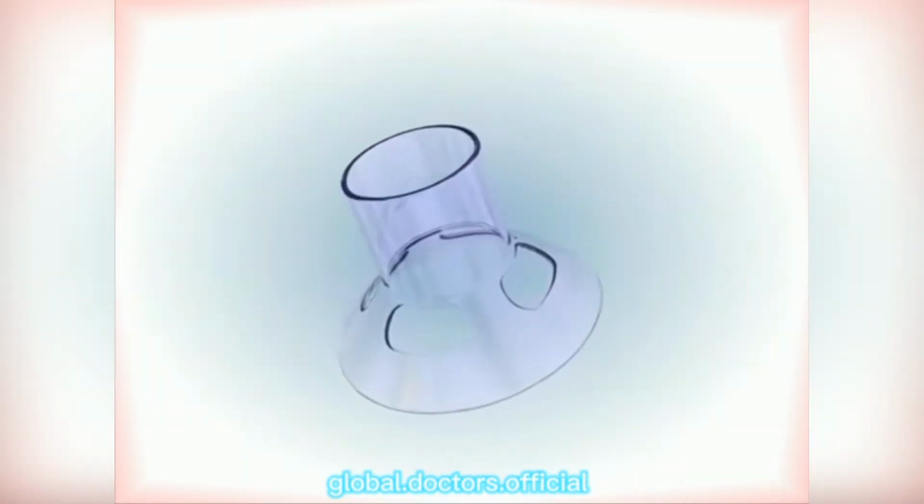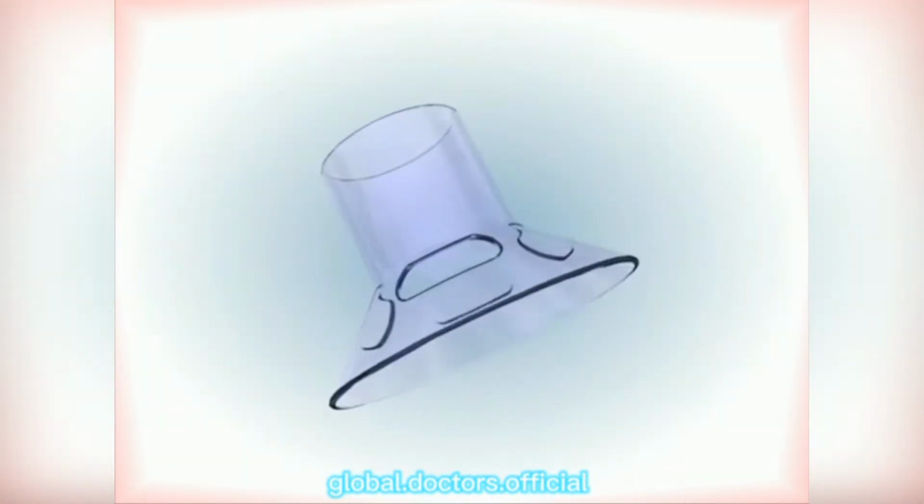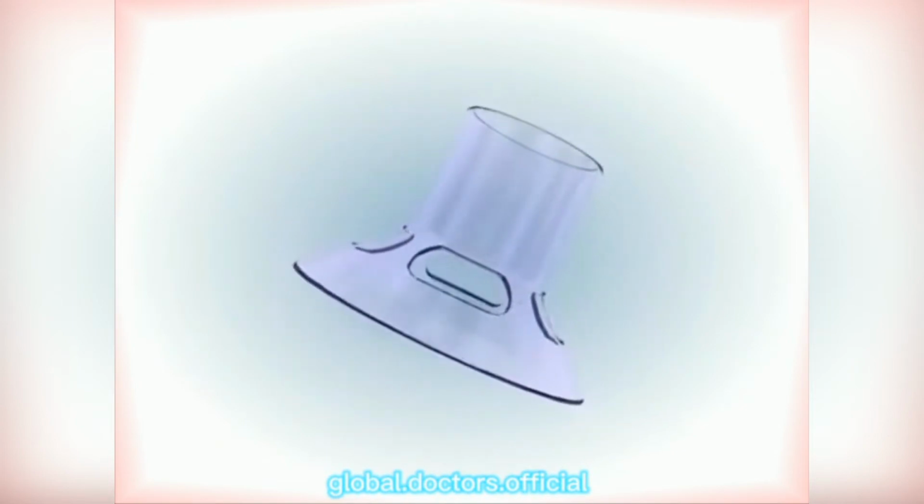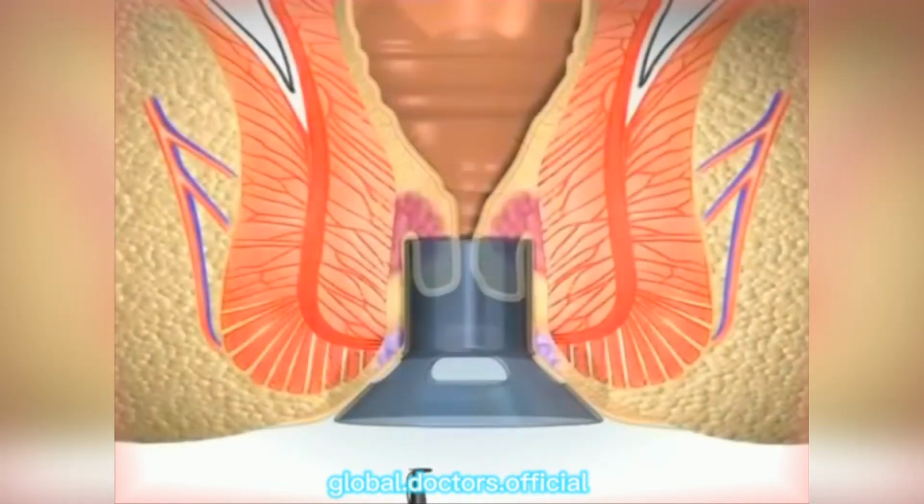The phalange of the circular anal dilator is provided with 4 slots in order to secure it to the perianal skin so that it is held firmly in place. The circular anal dilator is fully inserted and affixed to the perineum with 3 to 4 sutures.